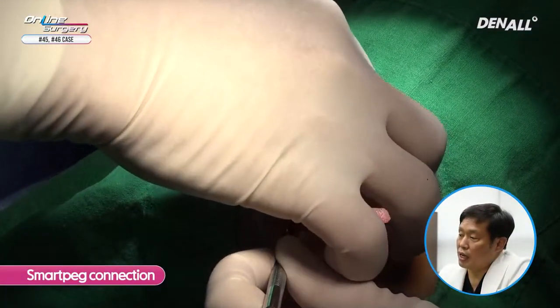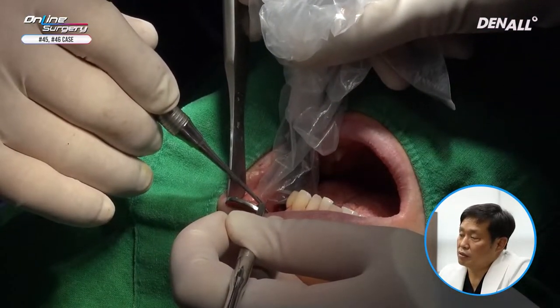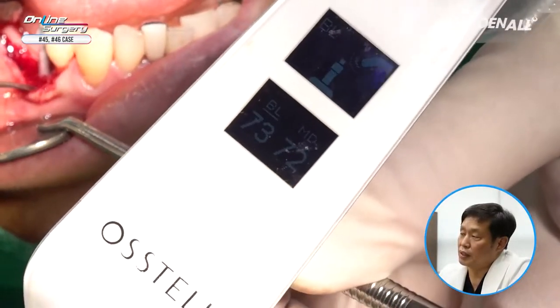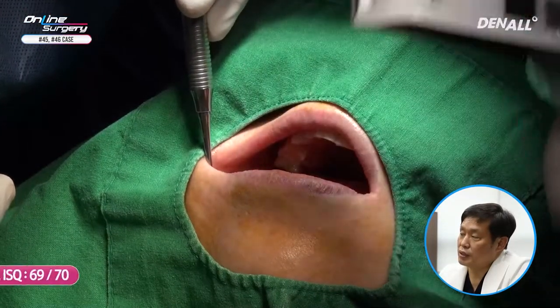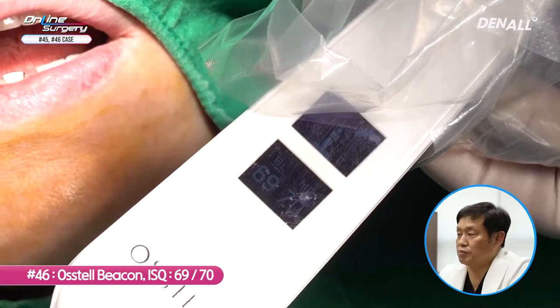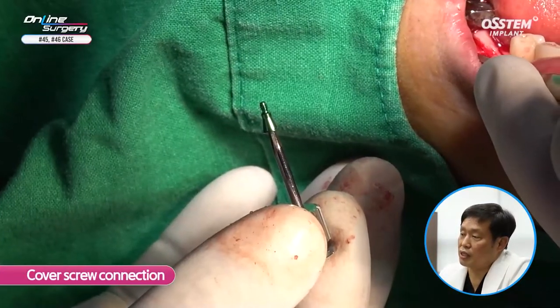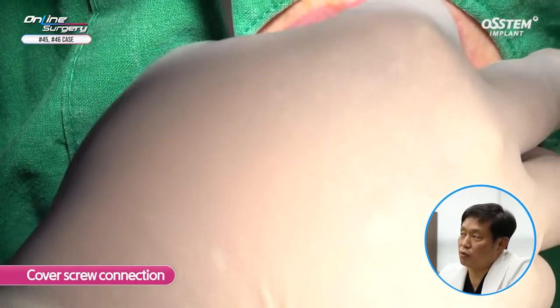SmartPeg was connected to measure ISQ value. In number 45, it was about 73 and 72. Because under-drilling was done in number 45, the ISQ value was higher. Cover screw was connected.